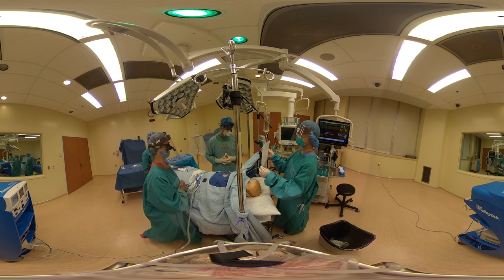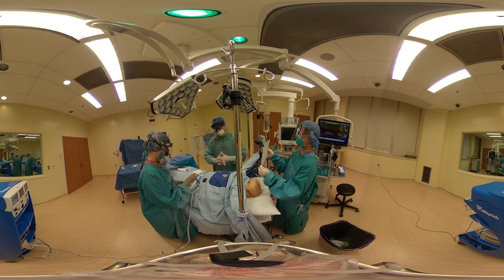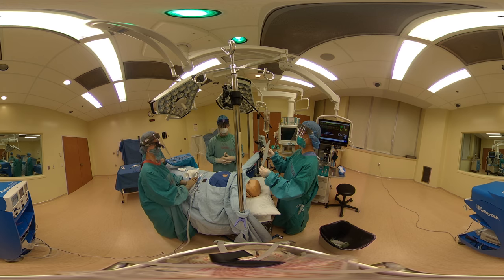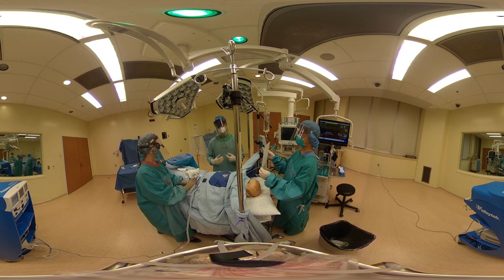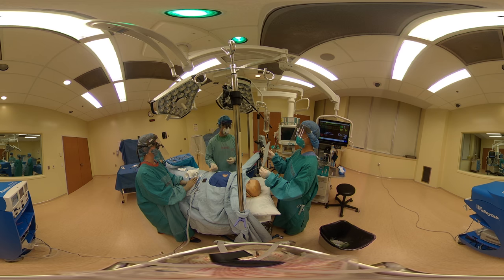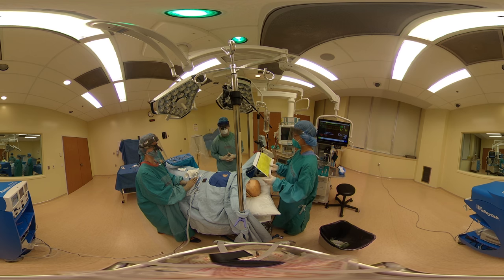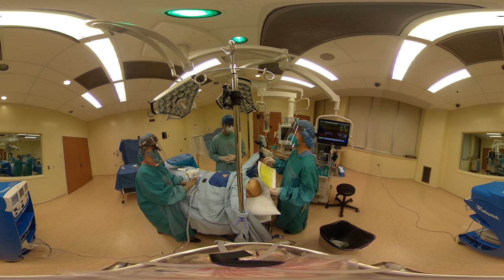Fire risk is a three. To reduce the risk of aerosolized particles, we'll use judicious cautery with smoke-vac, and we'll discuss specific measures to reduce aerosolization and contamination of the room. Specifically, if dissection and exposure of the trachea is favorable and insertion of the tracheotomy tube appears easy, then perhaps we will paralyze once the trachea is exposed but before creating the actual tracheotomy window. If there's any accidental circuit disconnect, I'll immediately let the team know.